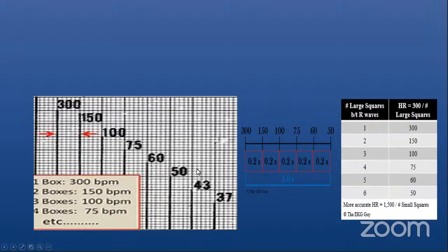Yeah, I think so. Sikandar is not online, but I think so. You explained it. Arjun, can you talk about the involvement of EKG during the resuscitation of newborn? Because this is the recommendation from the last update, and in this update they are very much into it, that if you have the facility to put the ECG leads as soon as possible during the resuscitation. What is your comment on that?